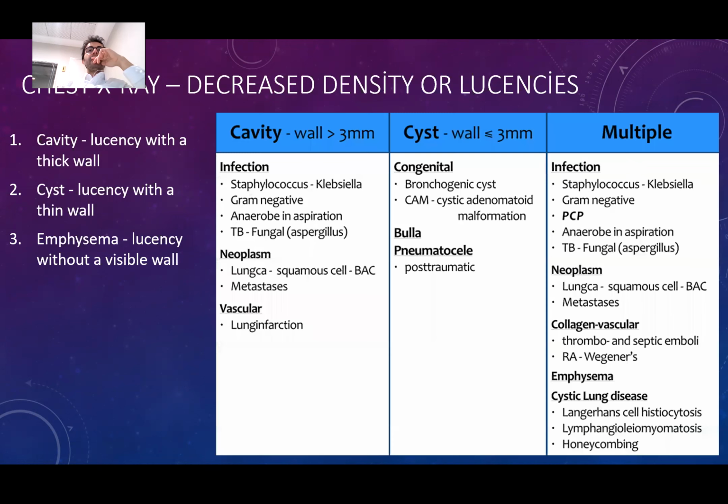There are multiple etiologies that we can think of. Usually cavities are formed by infections, right? Sometimes when there's a big mass lesion like a cancer and it has necrosis inside, it forms a cavity after necrosis, especially with squamous cell.